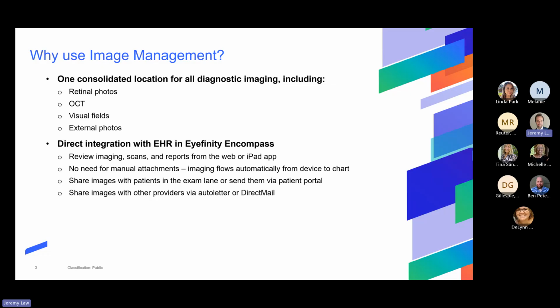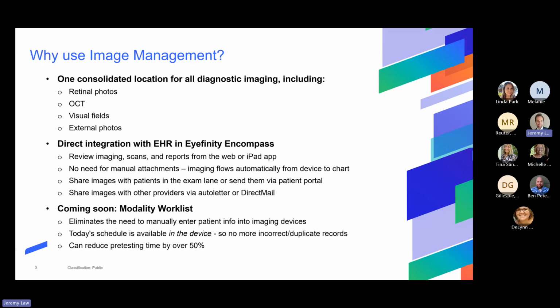And then finally, if you're going to share images with other providers, so maybe you're going to refer them to an MD or you want to show their PCP the progression of the diabetic retinopathy, and ask them to take a closer look at the patient and managing their diabetes, you could do that via our auto letters feature or direct mail, basically any of the ways that you're referring patients today.